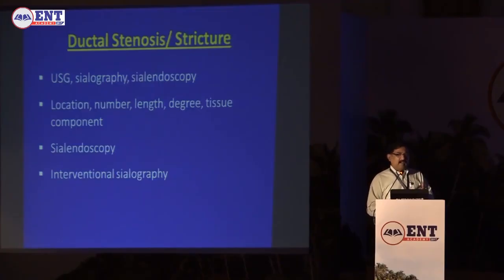Then you forcibly infiltrate hydrocortisone with saline solution. That is hydrostatic dilatation. Even without mechanical dilatation, it works. It especially works for juvenile parotitis and also this iodine 131 parotitis. These are now treatment protocols which are done by junior doctors in our hospital. Patients who come with these kind of things, in fact, after salivary endoscopy, post-op care, just like our endoscopic cleaning, they do this kind of injecting into the duct to dilate it and to clean it.